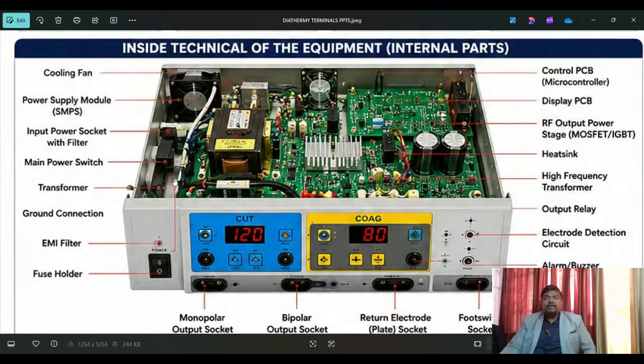Okay, right. So in this equipment you find all these components. Sometimes the battery also gets damaged, because it is not going to discharge. So if you get a complaint, you have to check everything one by one. Sometimes a minor issue will be resolved, sometimes a major issue will be found, and then you check whether the board is damaged or not. From there to there, using a multimeter, you have to check the continuity of all the components.